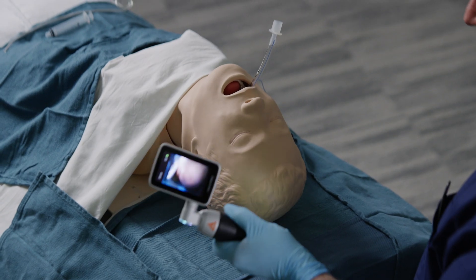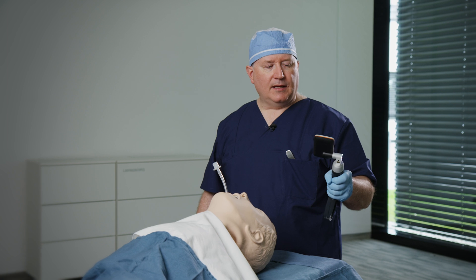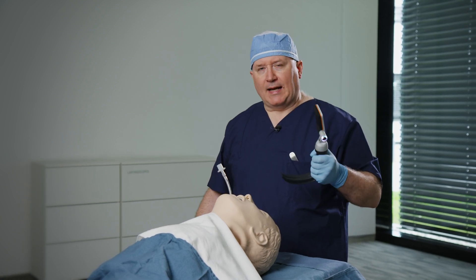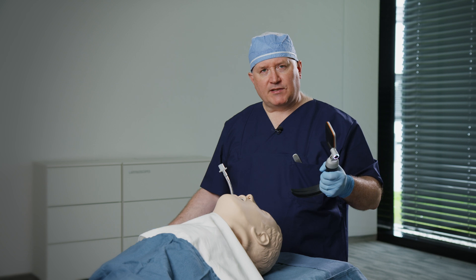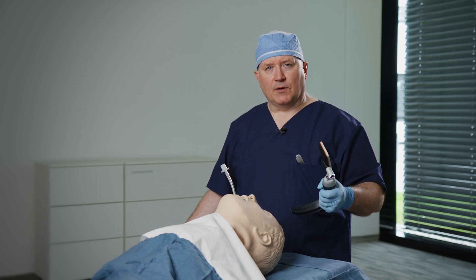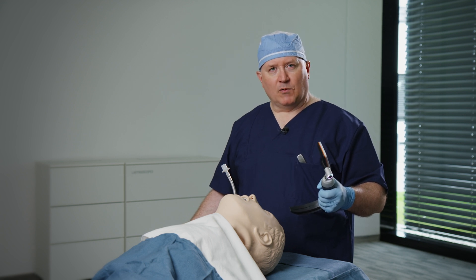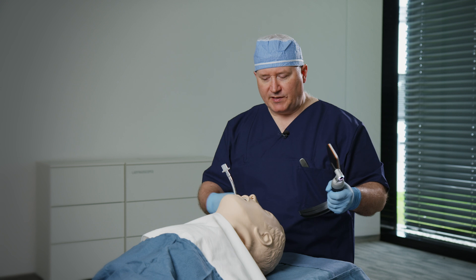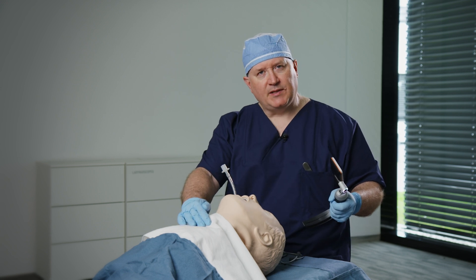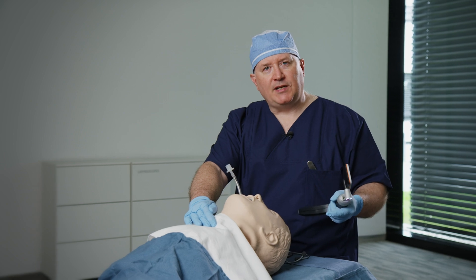This is a combined direct and video laryngoscopy system. The illumination and magnification of the system allows me to communicate with my assistants. And should I experience any difficulties during the procedure, my assistants or even my colleagues can assist me, or even perform procedures such as external laryngeal manipulation or changing of the patient's position to facilitate intubation.